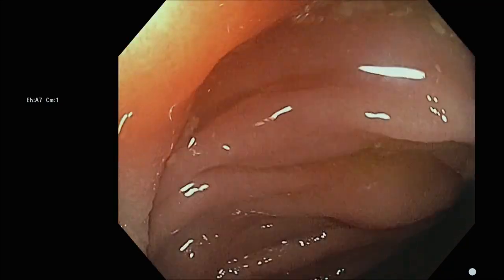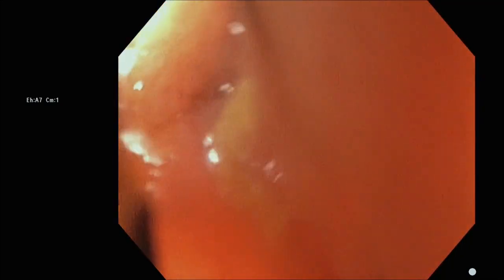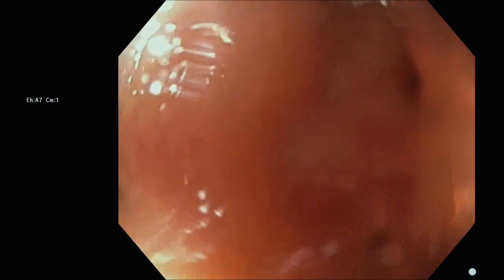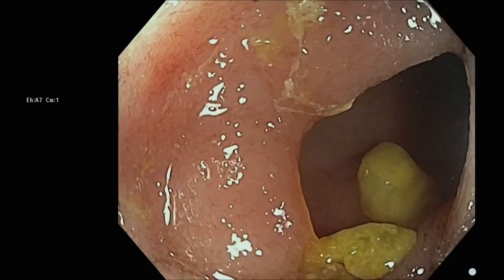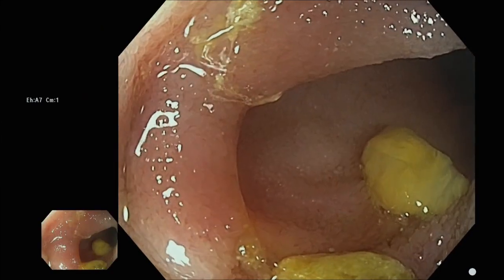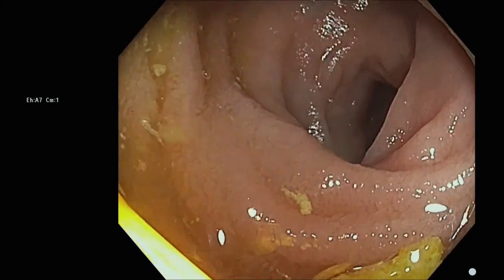So this is what I mean by the direct approach. You just deflate a little bit, visualize the lips of the valve, and then drive the scope tip up there and wedge the scope by deflection between the lips until you pop in. And if you have nothing on the end of the scope, you can do this even with an adult scope, and almost everybody who's undergoing normal surveillance, screening, diagnostic examinations. Occasionally a little bit of abdominal pressure, especially in the right lower quadrant, can help.